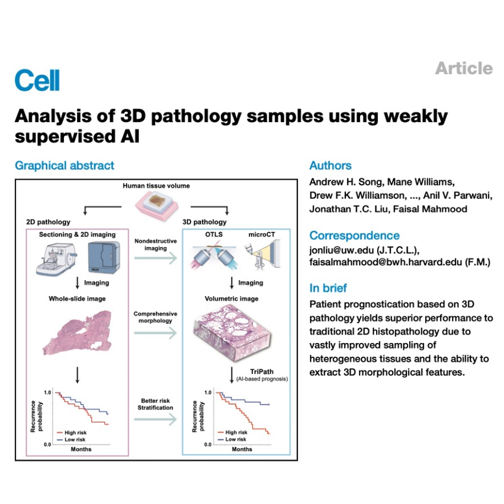They analyzed the whole simulated volume using 3D features, TriPath's main approach, and the prediction accuracy measured by AUC was incredibly high, like 0.974, almost perfect. But if they analyzed the same volume but only allowed the AI to use 2D features, sort of like stacking individual slices, the AUC dropped quite a bit, down to 0.803. Still decent, but a big drop. A significant drop. And then if they simulated standard pathology, just looking at a single 2D plane through the volume, the AUC plummeted to 0.677, barely better than chance.